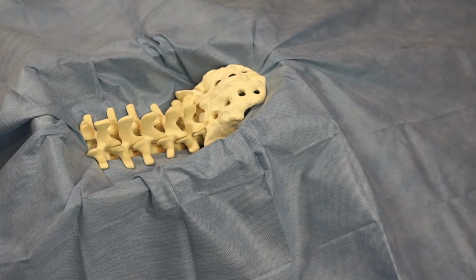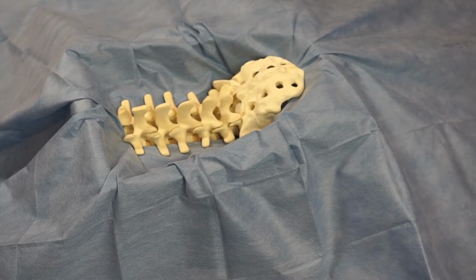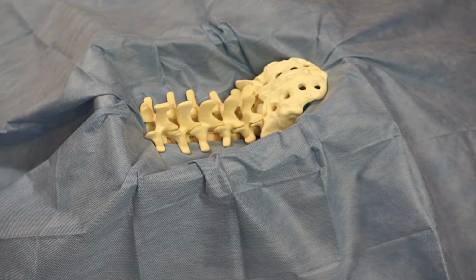Position the patient in the prone position on the operating table. Identify the spinous processes at the appropriate level using intraoperative imaging. Create a midline incision 2 to 4 centimeters in length to expose the spinous processes at the appropriate level.